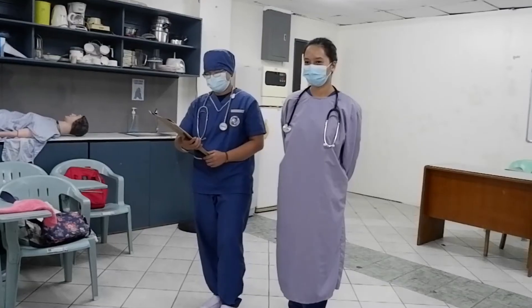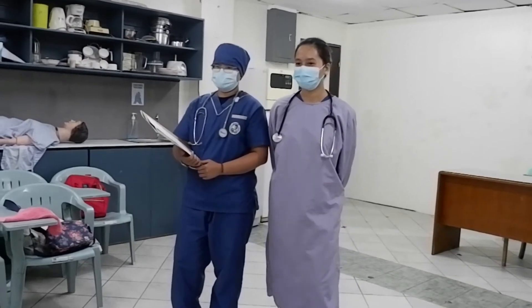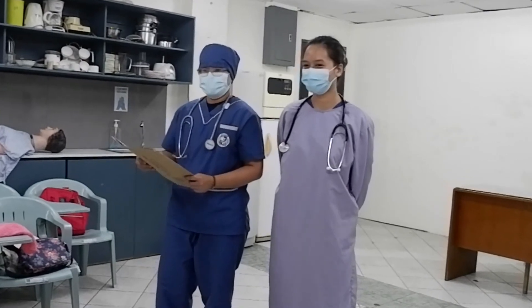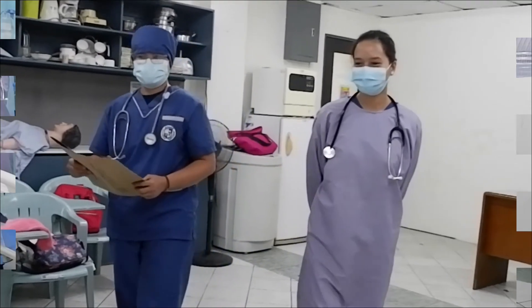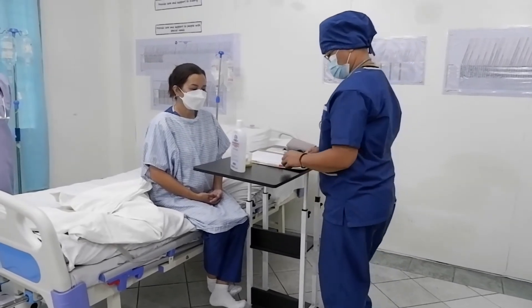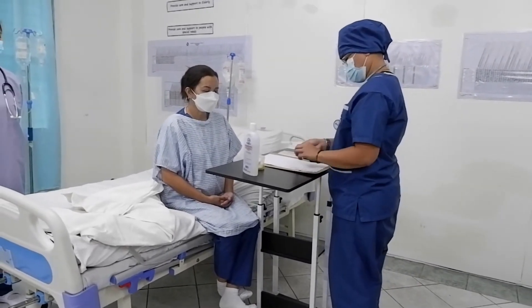Hi Miss Rose, I am MJ, I am your caregiver for today, and I am with Dr. Sapno. It is time to get your vital signs. The first thing we need to do is disinfect the thermometer using cotton with alcohol.